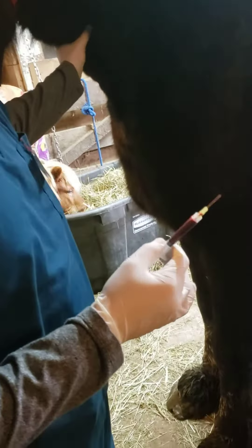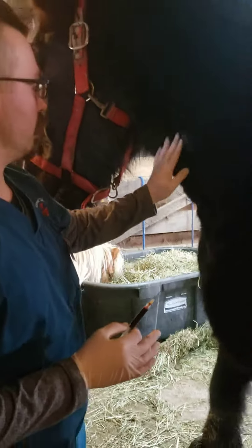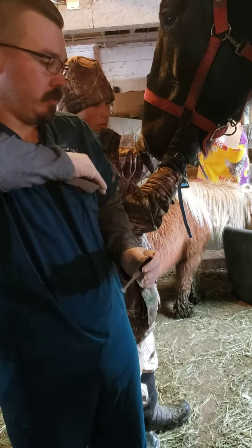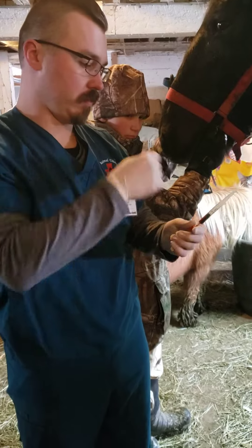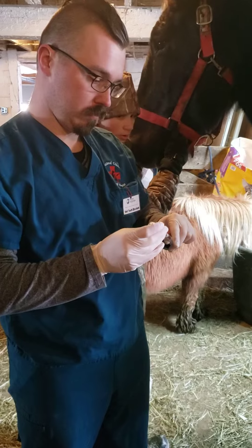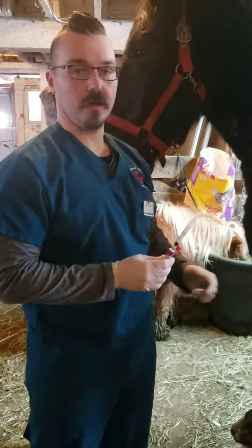I'm just going to hold off for a second there. Blood tubes here. And we're done.